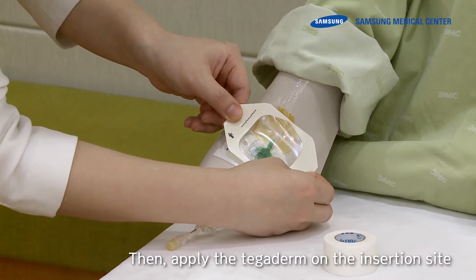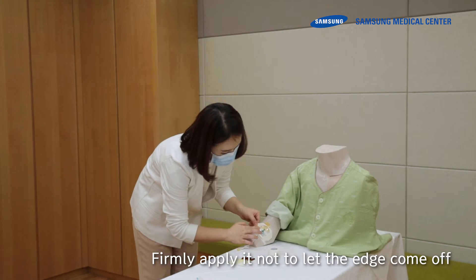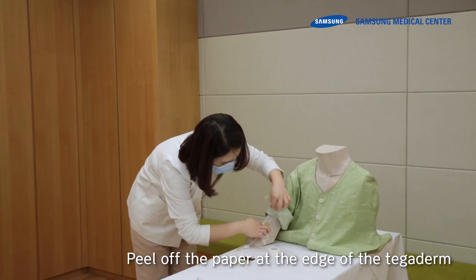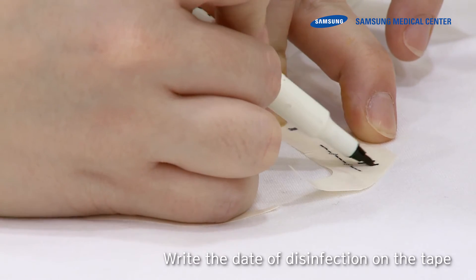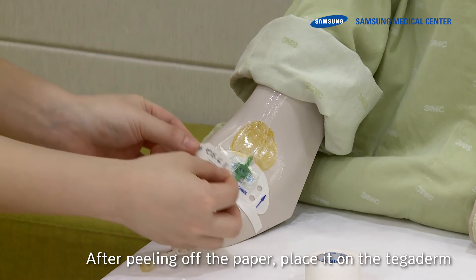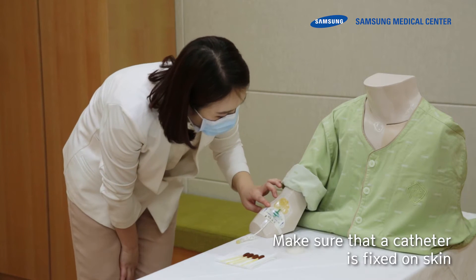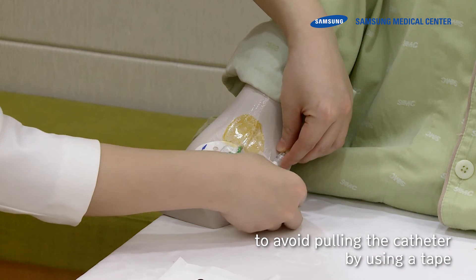Apply the Tegaderm on the insertion site. Firmly apply it so the edges do not come off. Peel off the paper at the edge of the Tegaderm. Write the date of disinfection on the tape. After peeling off the paper, place it on the Tegaderm. Make sure that the catheter is fixed on the skin to avoid pulling the catheter by using a tape.